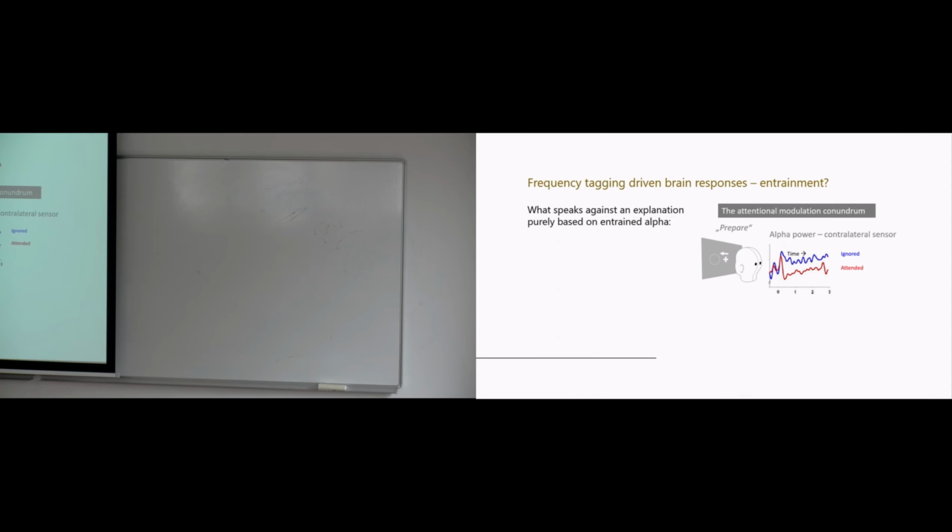this is the position that they're looking at. So this electrode here is over a hemisphere that represents that position, okay? So this electrode will then have a higher alpha power when this position is ignored than when it is attended, which has something to do with how our visual paths cross and how alpha suppression points in the counterintuitive way, right?